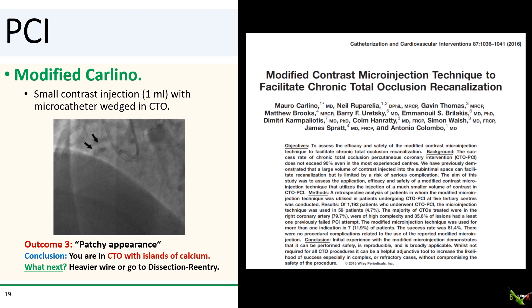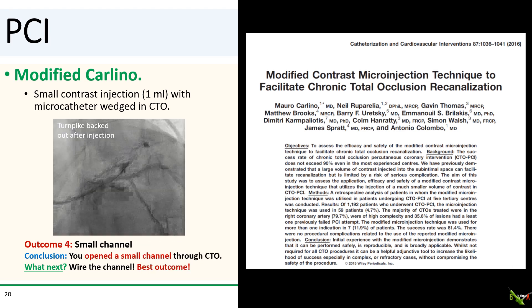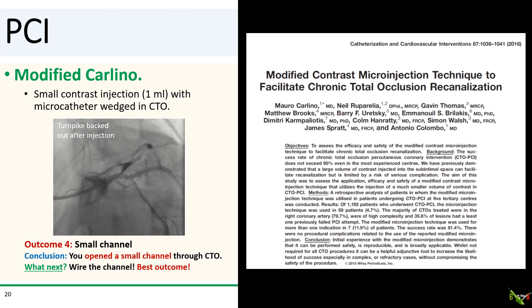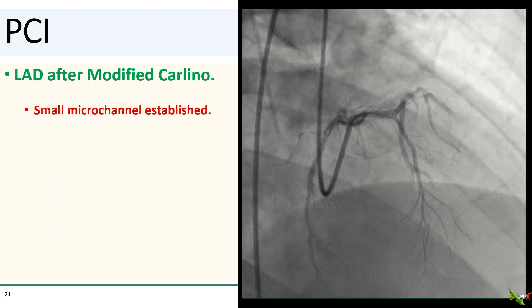The third possible outcome is a patchy appearance — if you see this, you are in the main CTO vessel but in a segment with fibrous tissue intermixed with tough calcified islands. Your options are either to use heavier wires to get through the calcified islands, at the risk of perforation, or go to dissection re-entry. The fourth possible outcome is what happened to us — the injection can actually create a microchannel that crosses the CTO. Here you see the microchannel in our case; we had backed out our Turnpike microcatheter after the contrast injection to be able to see the channel.